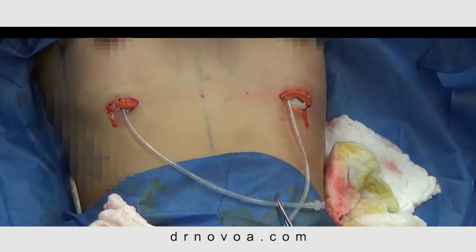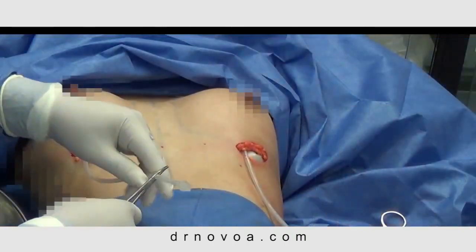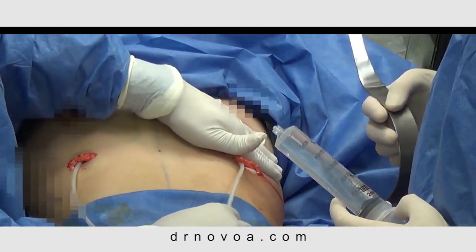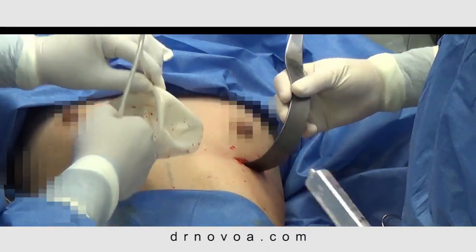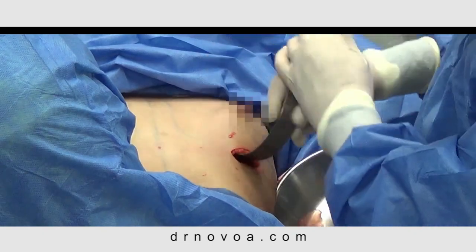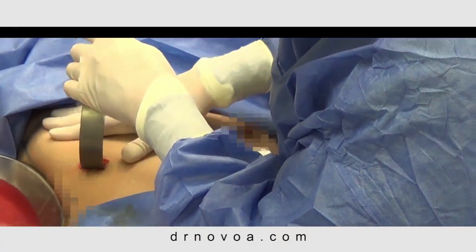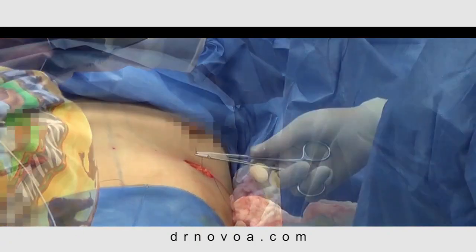The patient is allowed to see the tentative size of augmentation from a seated position, and then she decides her final size. The patient is placed back in the supine position and her sizers are removed. The implant pockets are then washed out with antibiotic solution. The incisions are prepped for closure in multiple layers using absorbable sutures.